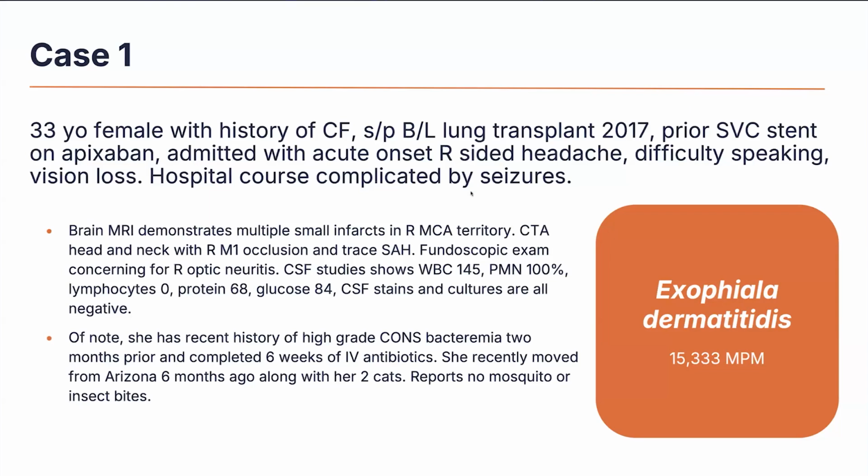This is one of the areas where Karius is quite promising, which is your fungal infections. And these are frequently not picked up by your cultures or serologies. And so timing of diagnosis is of the essence in how you manage these patients.